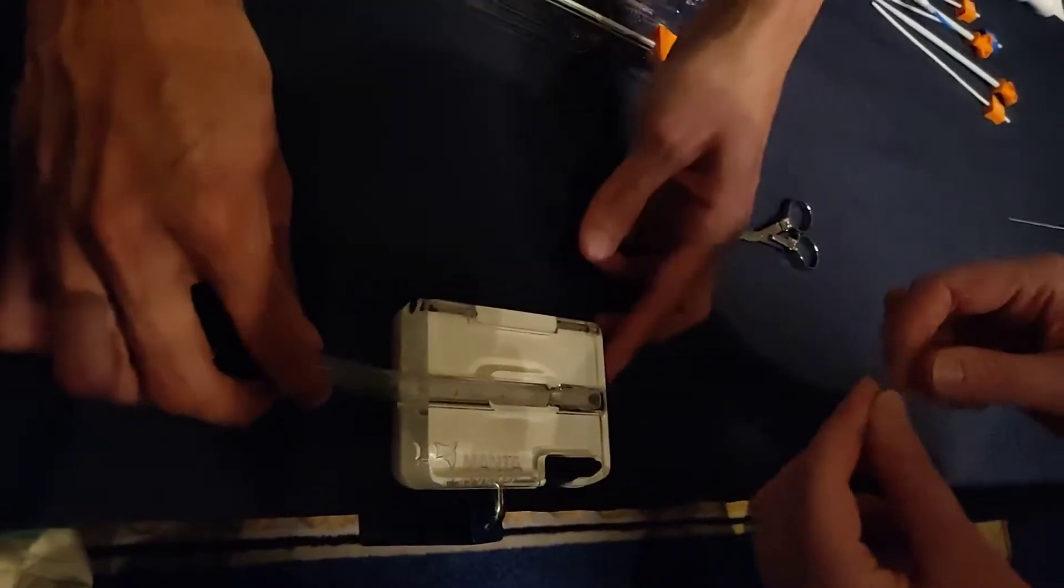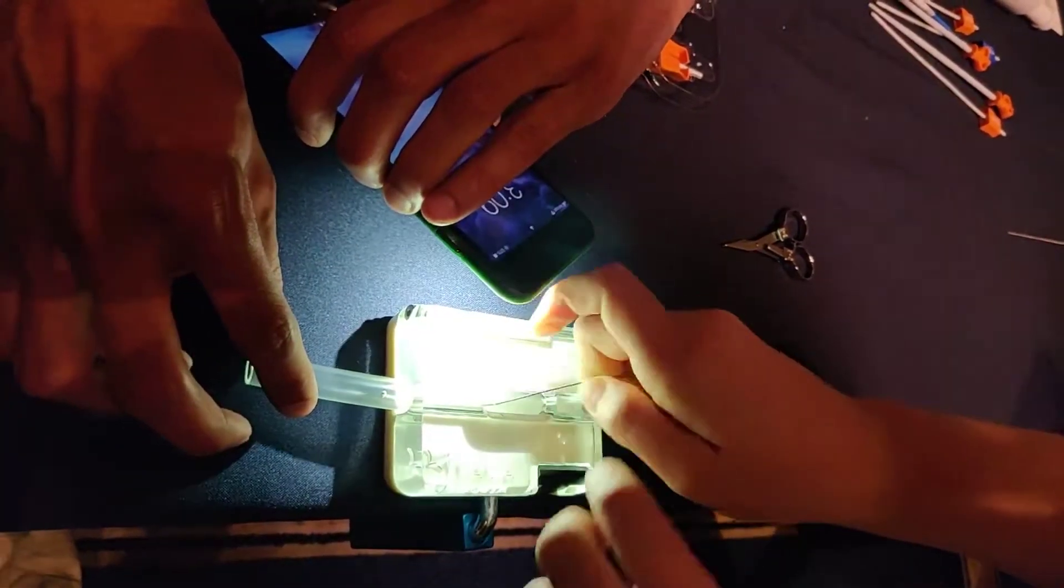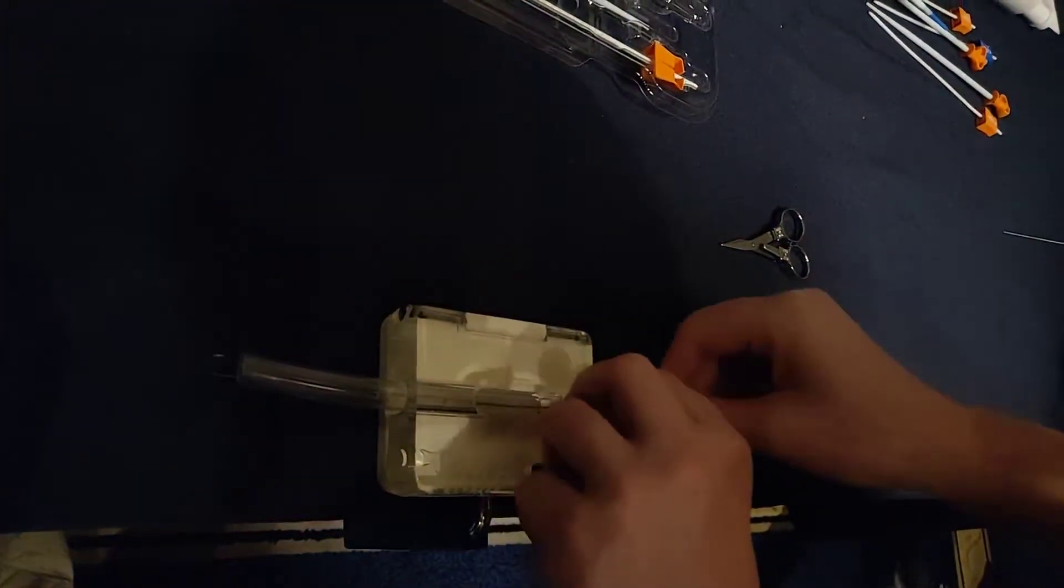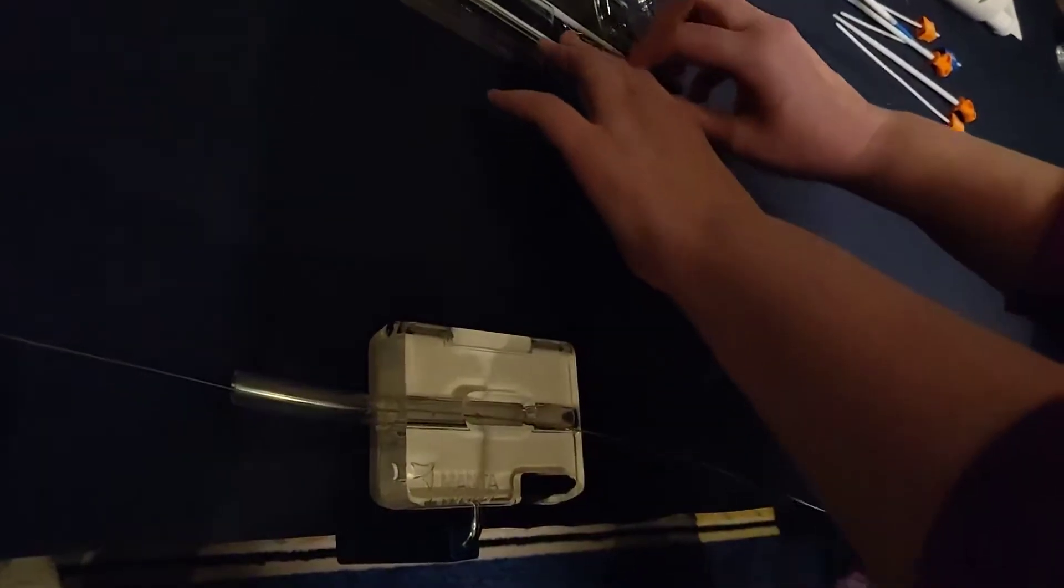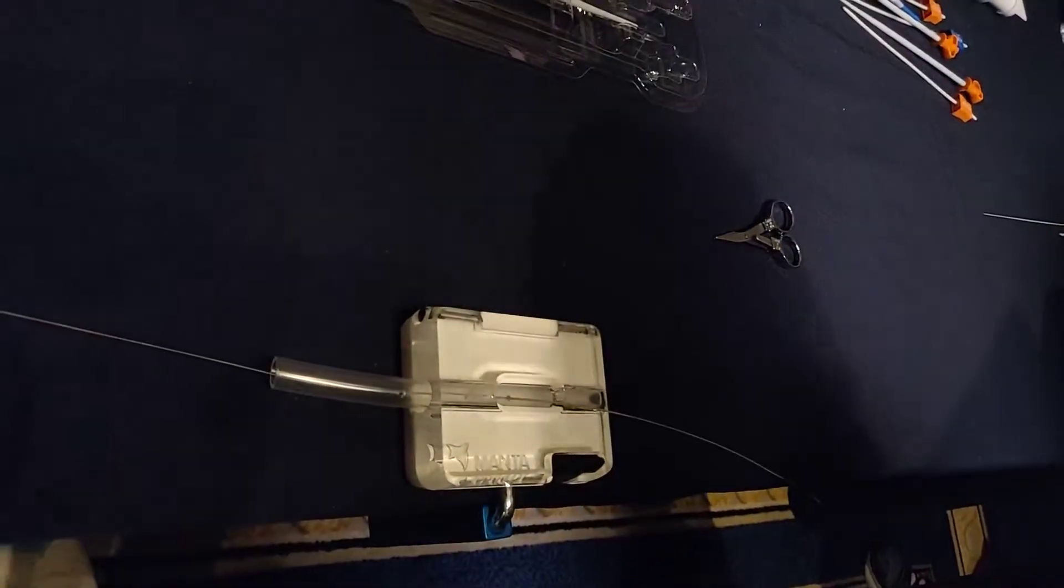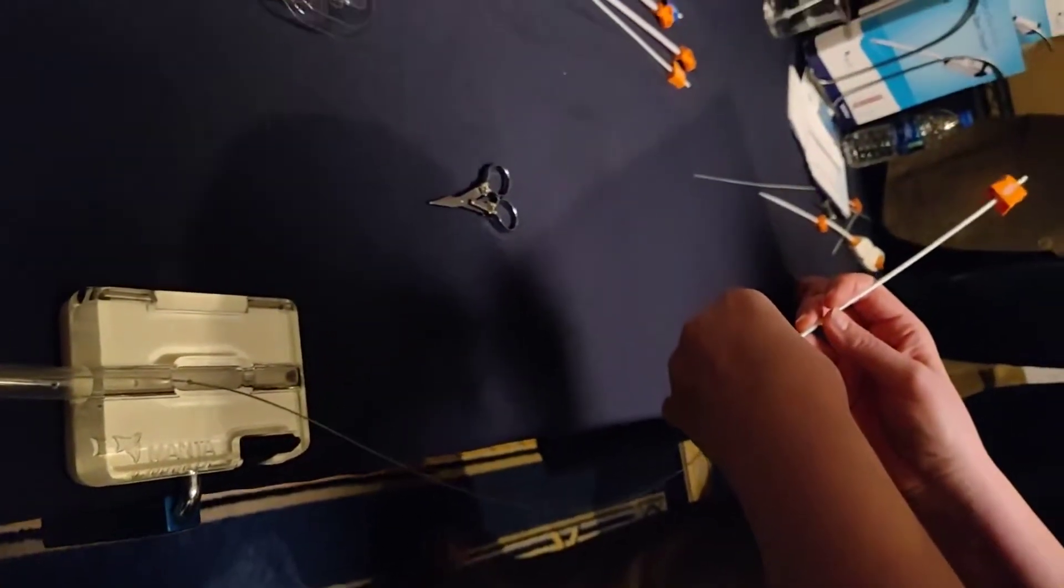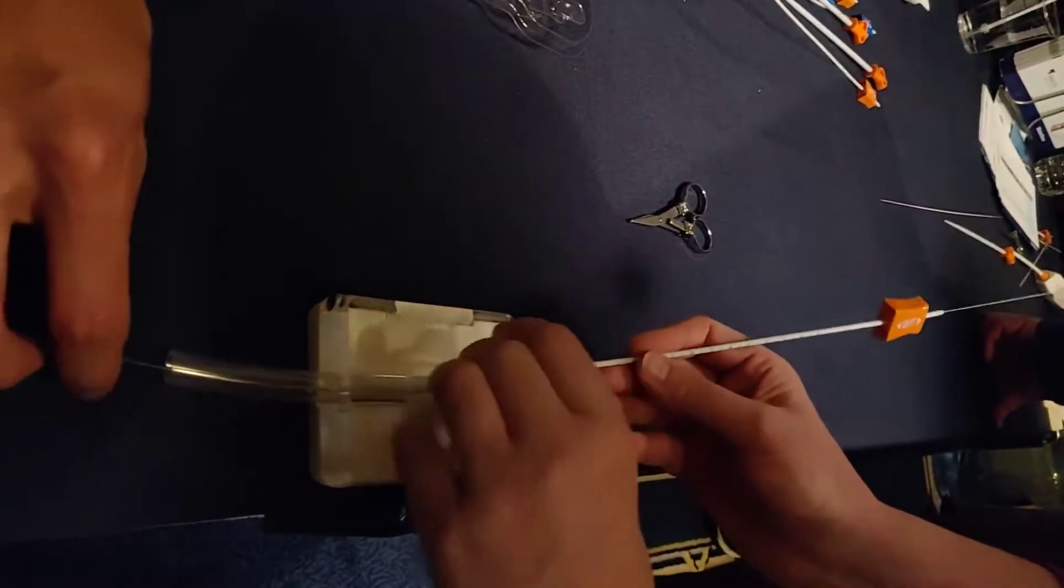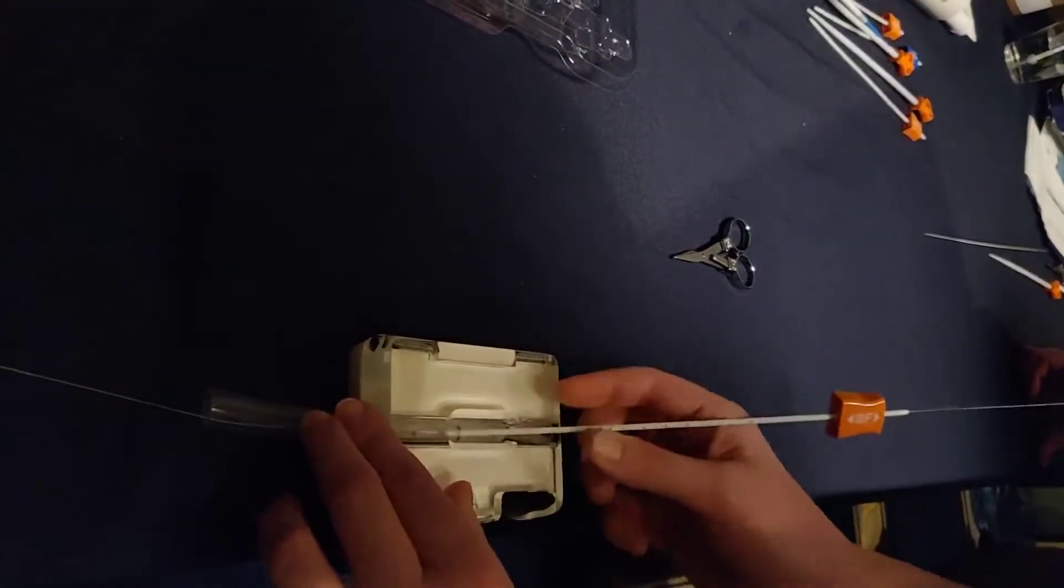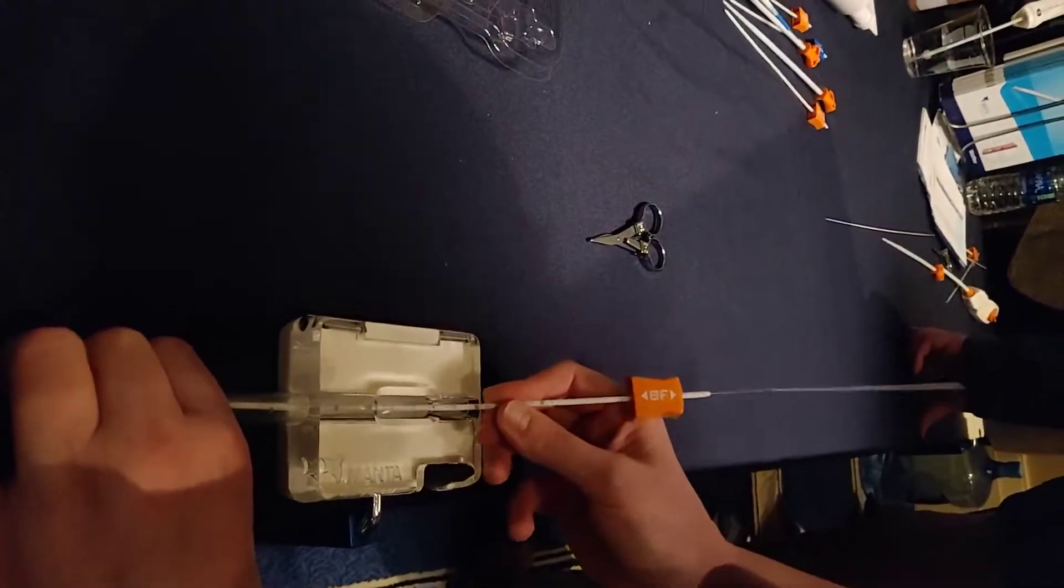Okay, I'm gonna have you go through this super small hole, so I apologize. So again, we're gonna do this before the case. Is this for measurement?